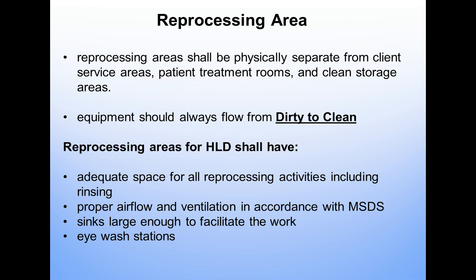So a reprocessing area, this is a very contentious issue for some people, but certainly when your area is audited, this will be identified: reprocessing areas shall be physically separate from the client service areas. It's been common for the last 20 years that endocavity probes may be reprocessed in the client procedure room after the client leaves the room.